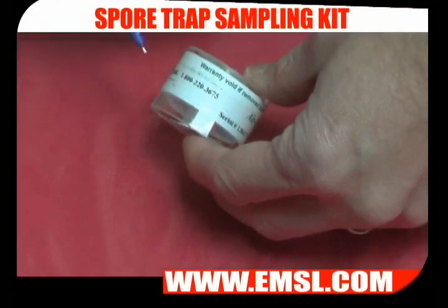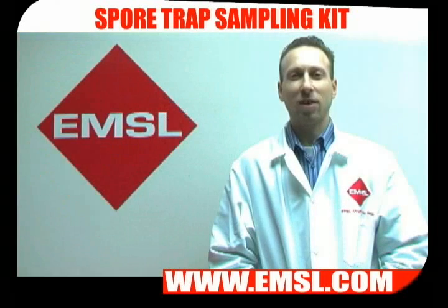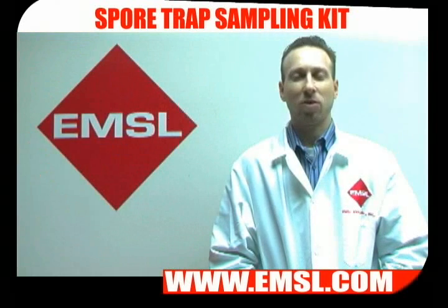Use your marker to label it and it's ready for shipment. Package your samples well and ship them to EMSL. You'll receive your results back in a standard turnaround time.